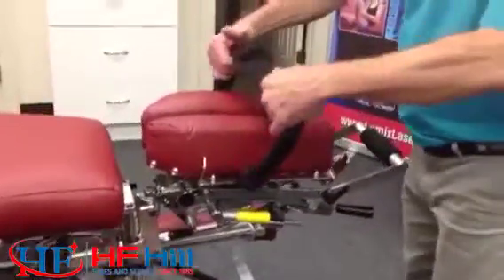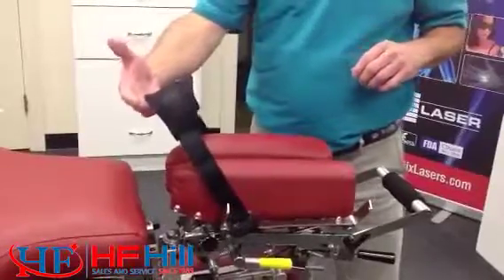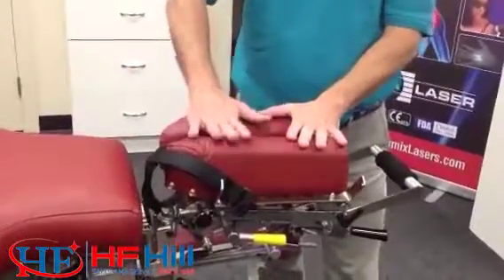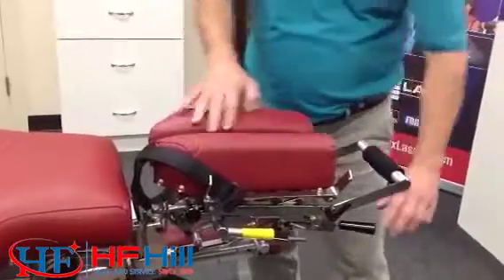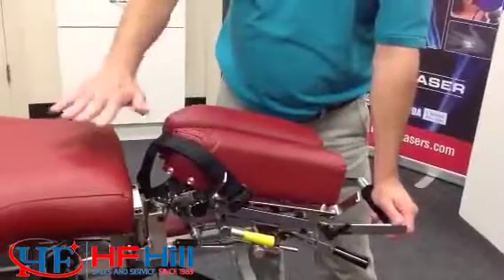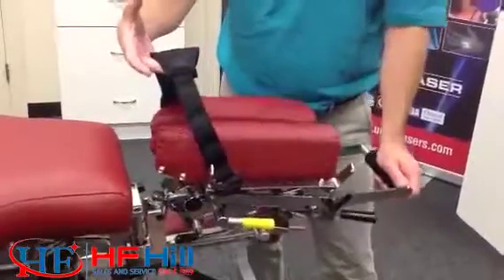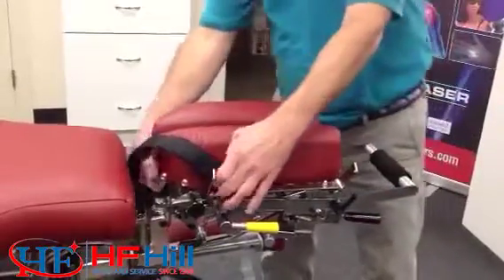The next piece we're going to discuss is the sub-occipital strap. Of course, the sub-occipital strap goes on the sub-occipital, and it's designed to keep a patient's head or face very close to the cushion set. So as you do your traction and go down, you want there to be some really nice cervical traction, and the only way that happens is if their head is coming down with the cushion. So the sub-occipital strap is very important to put in place.